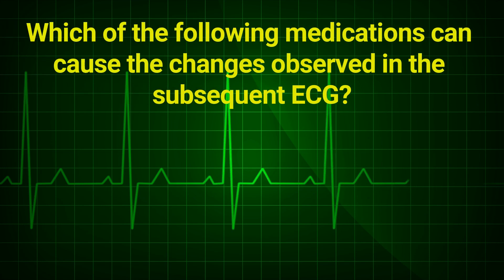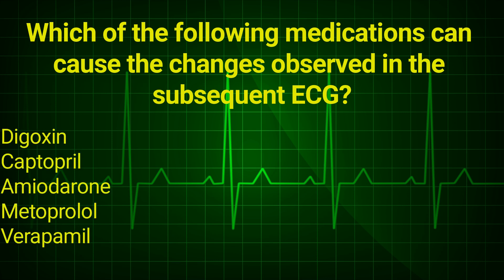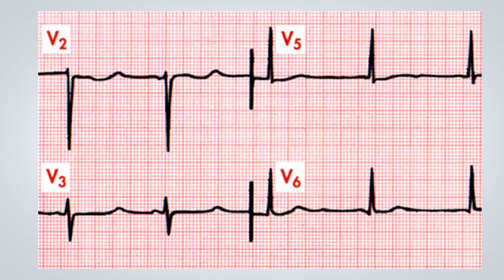Now on to the new clinical scenario. We will display several electrocardiograms and ask you which of the medications, from a list of alternatives, could potentially cause the changes in the ECG we're about to show. For the first ECG, we want to know which of the following medications might cause the electrocardiographic changes we'll observe. Our medication options are digoxin, captopril, amiodarone, metoprolol, and verapamil. Now, let's analyze this electrocardiogram.